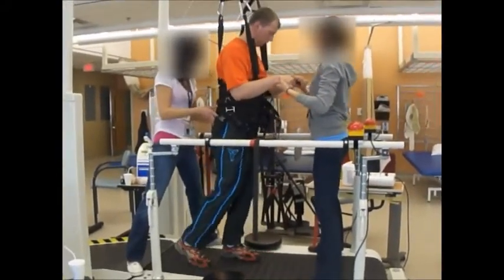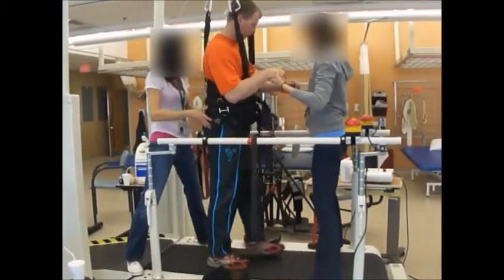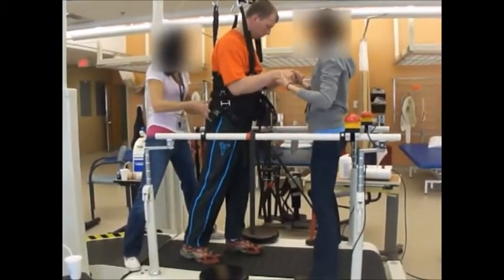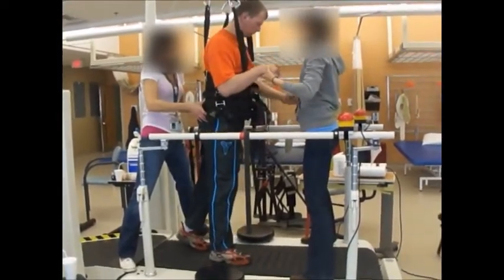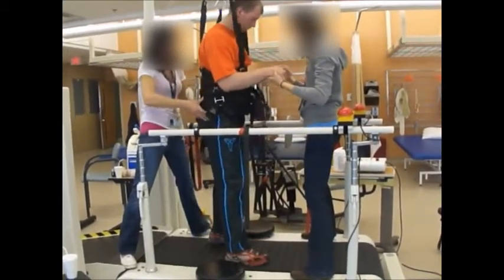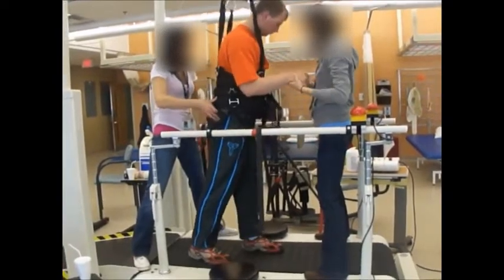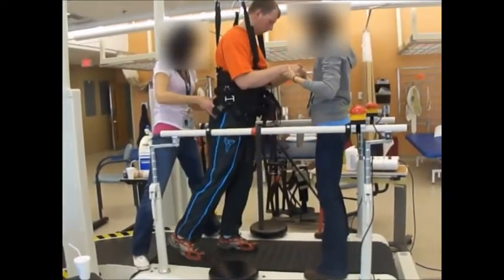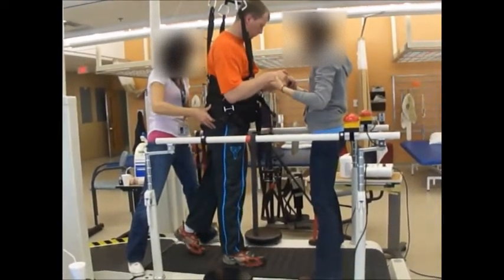From what I can tell, this machine costs around half a million or so, but it's a very nice machine. The treadmill goes pretty slow — maybe three times less than a regular one.